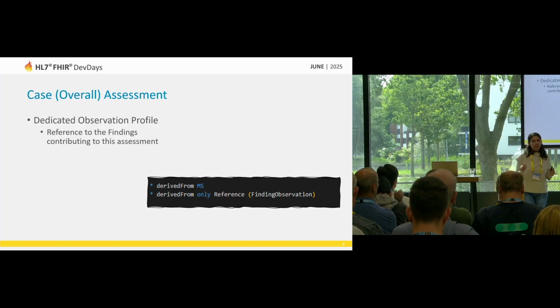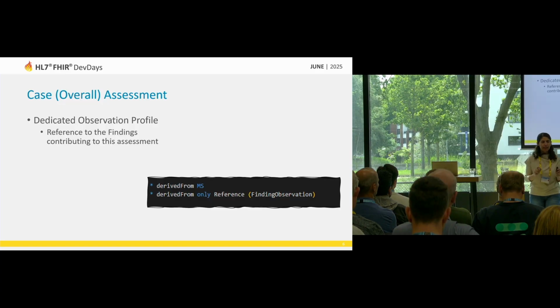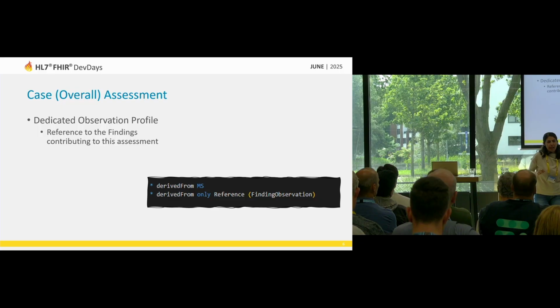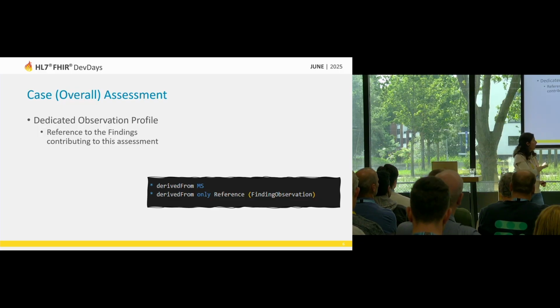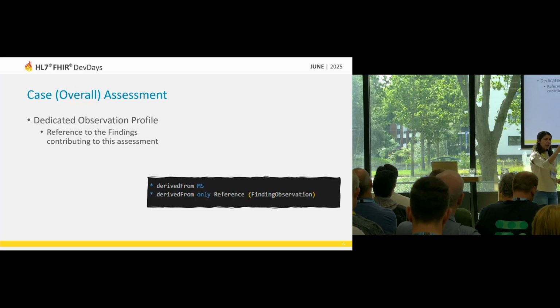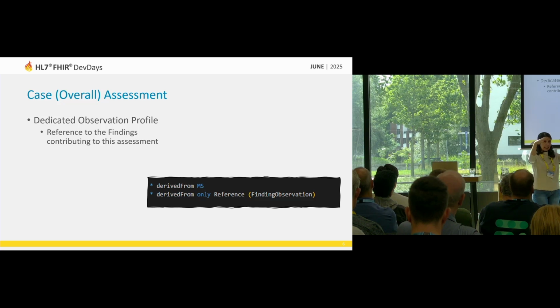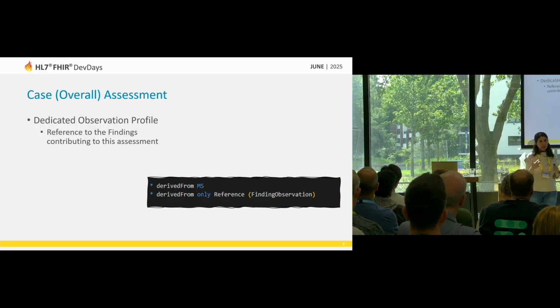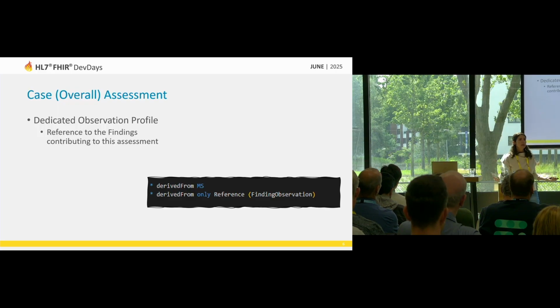However, not every single clinical guideline tells you that you should be doing this finding level assessment. Therefore, it is better if you are doing this derivedFrom with the reference to the finding itself, because with that you really can have the whole clinical context to be able to say, these are the findings that I am taking as input for this grade that I am giving to this case.